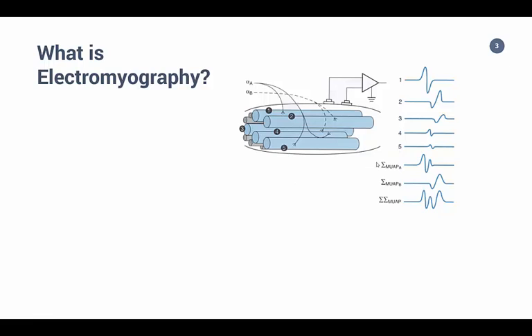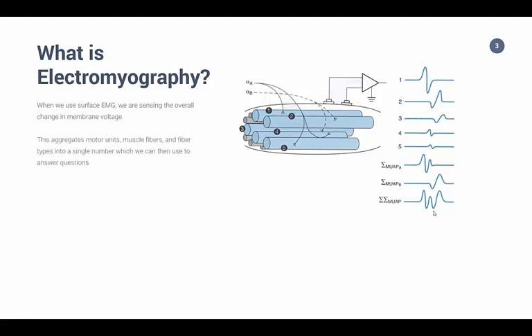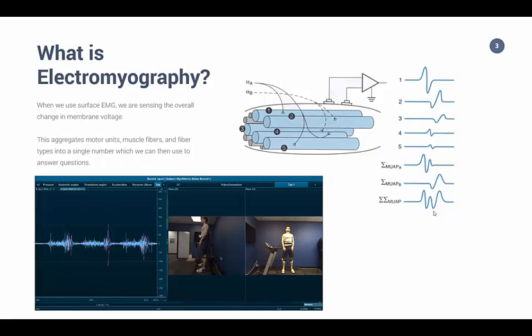This continued activation produces motor unit action potential trains. The trains from concurrently active motor units superimpose to produce the resultant EMG signal. In short, EMG is the process of measuring the summation of these action potentials, which results in a bipolar signal representing the neurological recruitment of a muscle.